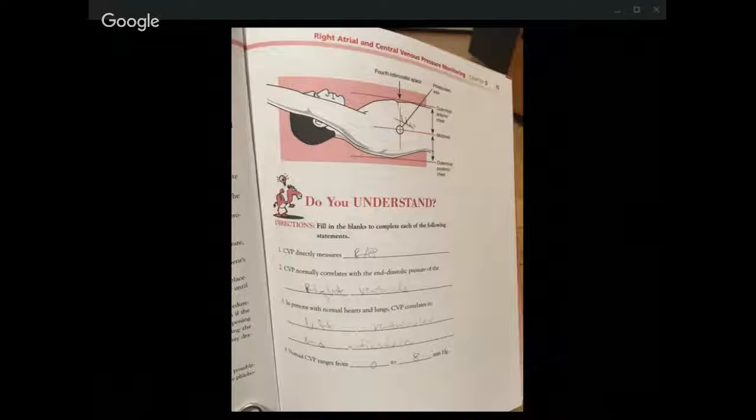A few other good questions that I'm not able to show are: how is the catheter determined? How is the type of catheter used for central venous cannulation determined? It is determined by the intended use or the patient's condition.